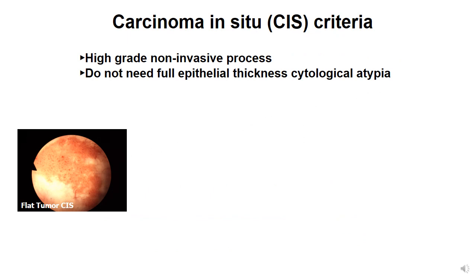So let us try to understand flat carcinoma in situ, which is one of the most important flat processes that you do not want to miss in your practice. This is a high-grade non-invasive process. A very important rule to keep in mind is that you do not need full thickness epithelial atypia to make a diagnosis of flat carcinoma in situ.